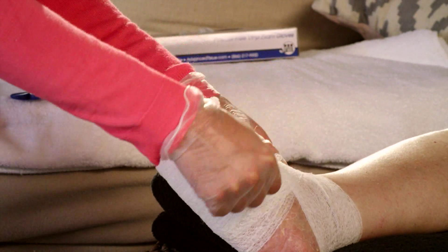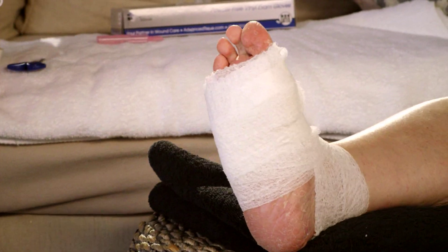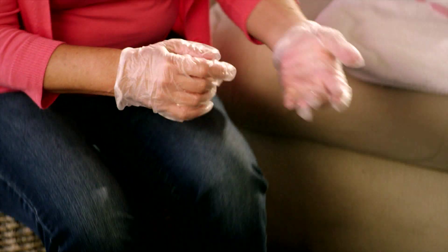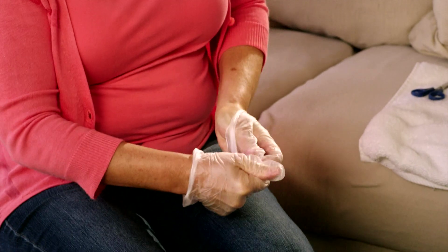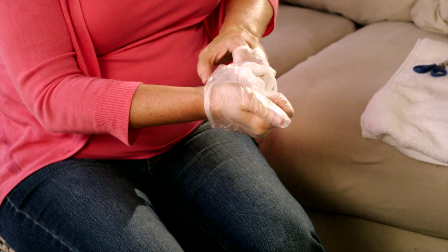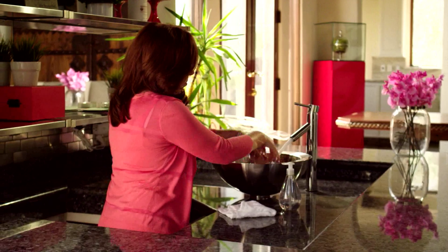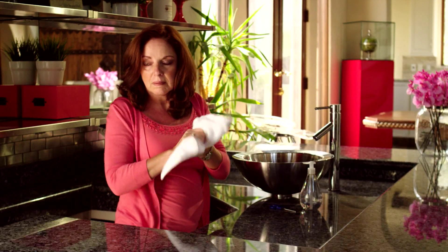And one more. There we go — simple as that. When you're finished changing your dressing, discard all materials, including your gloves. Remove one glove by only touching it with the other gloved hand. Then remove the second glove with your bare hand by sliding a finger under the wrist cuff and pulling it off. This will prevent contamination of your hands with wound drainage. It's also a good idea to wash your hands again after the dressing change.